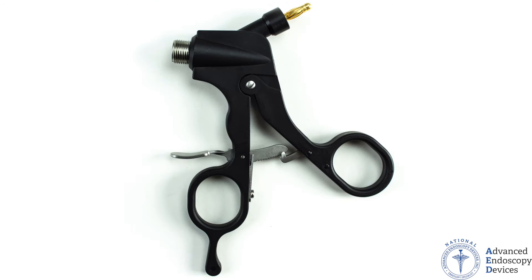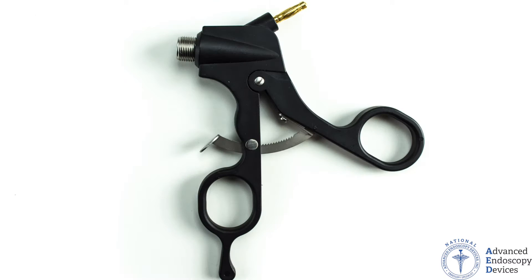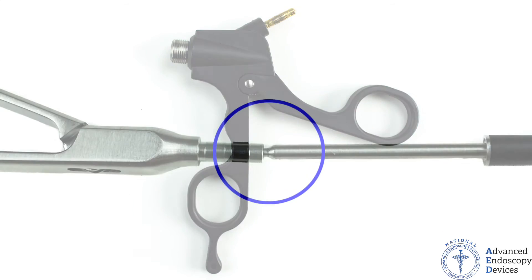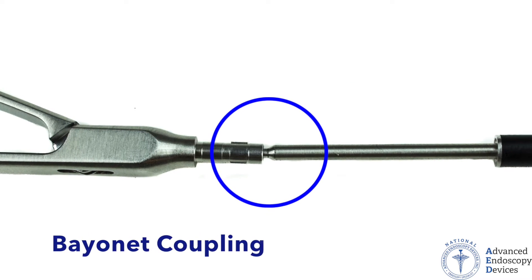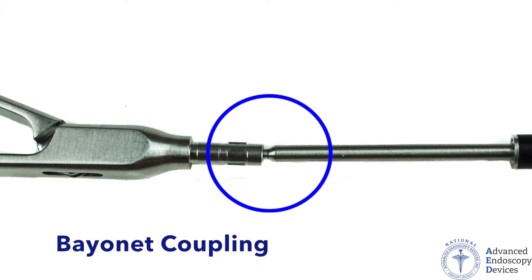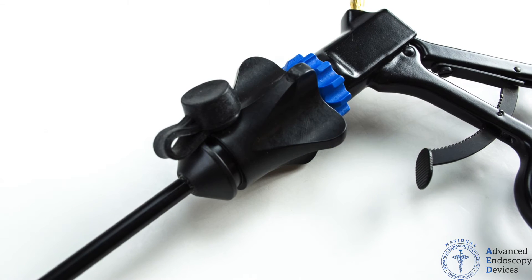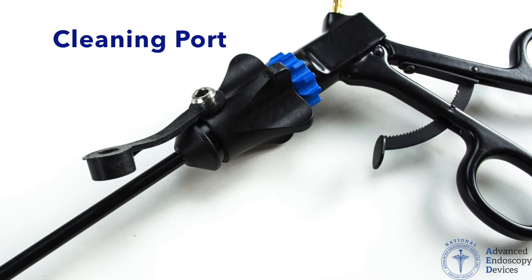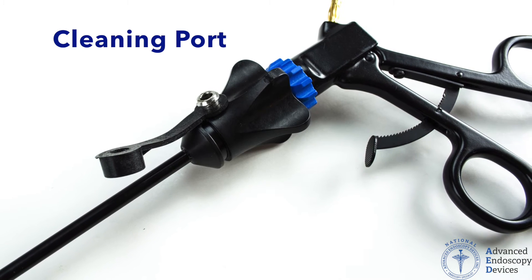SpeedLock's 10 popular ergonomic handle styles accommodate both large and small hands. Our new bayonet coupling also makes assembly simple and secure. Another highlight includes a cleaning port, which allows for easy and time-saving reprocessing without taking the instrument apart.